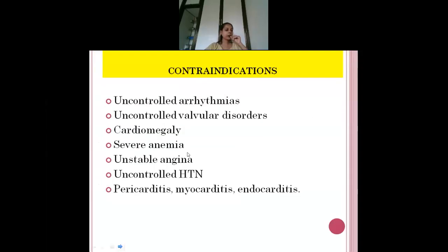What are the contraindications? We already saw the indications or purposes. We want to know what the contraindications are. Now there are a few important contraindications. In these cases, you should not perform a stress test procedure.